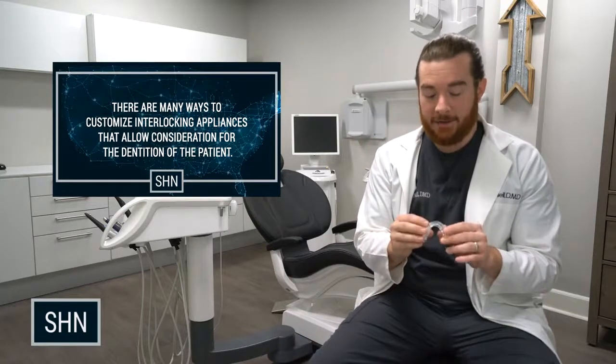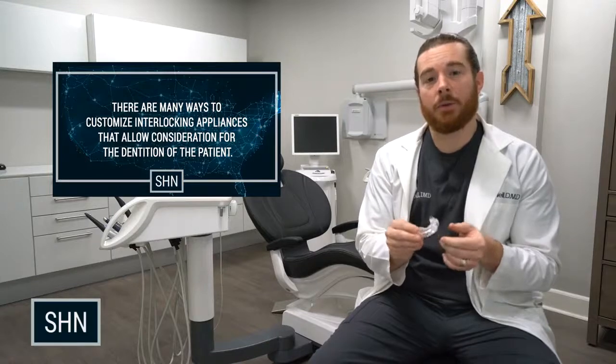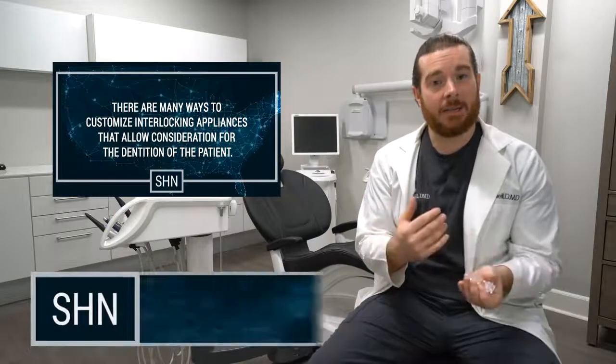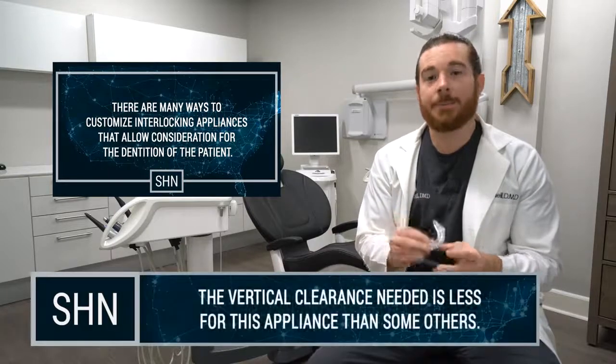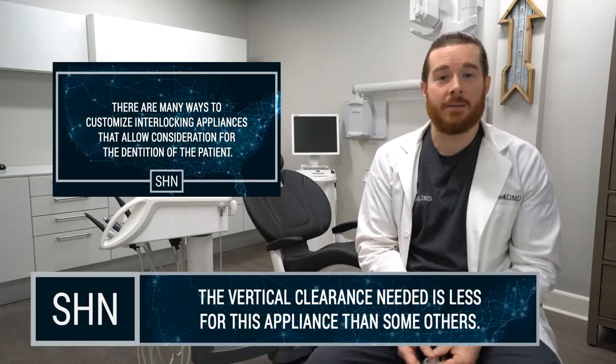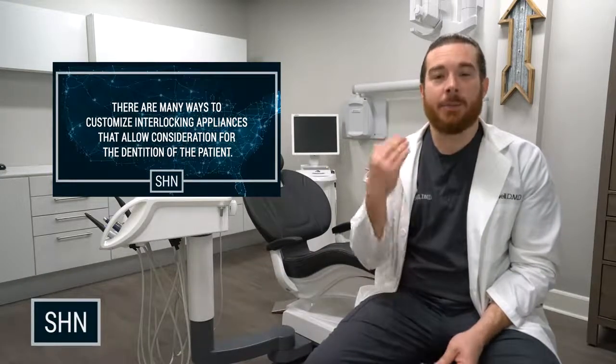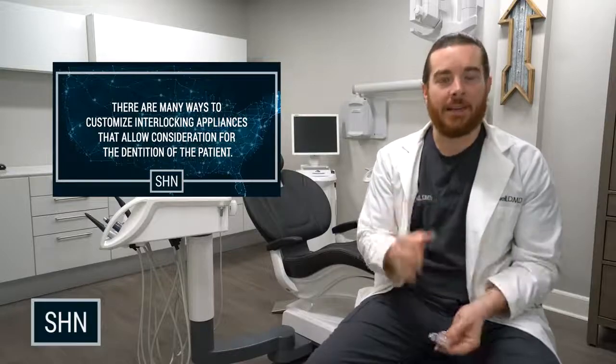The last feature that I like about the Micro 2 oral appliance is that the amount of vertical clearance you need is less than others. In this particular style, you only need three millimeters of vertical clearance. This is great for your deep bite patients because it allows the posterior to not be excessively open.